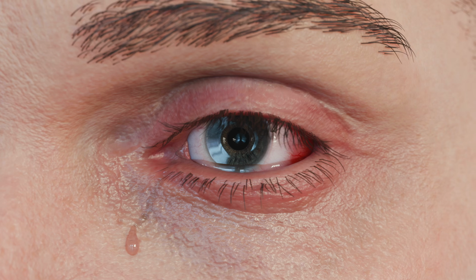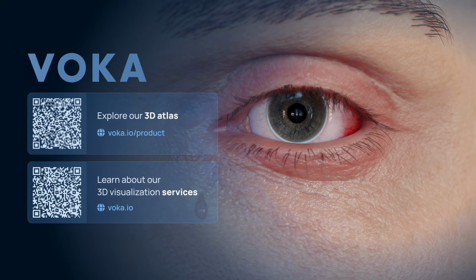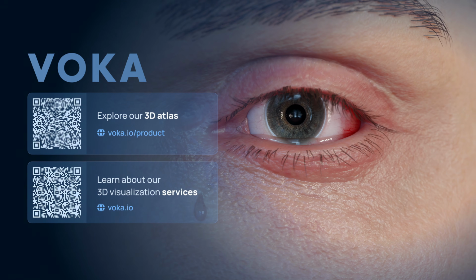Irrigation with a sterile solution is then performed through a cannula. The solution enters the nasal cavity, and the patient perceives liquid in the throat. Finally, antibacterial eye drops are instilled.